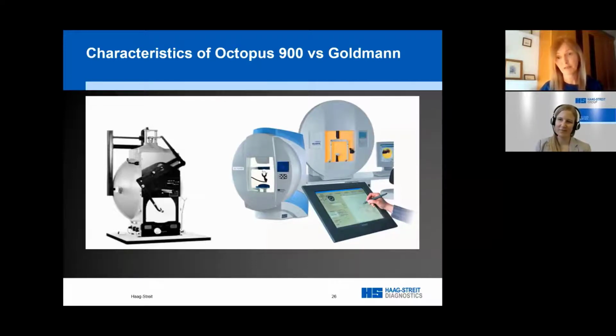And when I've been on training courses, a number of people have said to me that they worried that their skills would be in some way tampered with by changing to Octopus. And I do understand where they're coming from, but in honesty, I never found that to be the case, having changed over. The Octopus may move the target for me, but it's still me doing everything else.